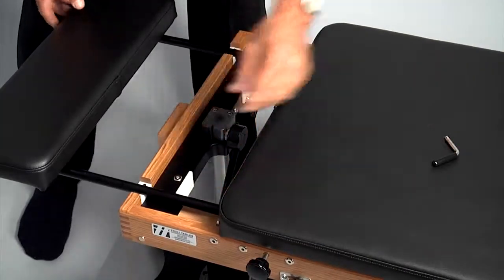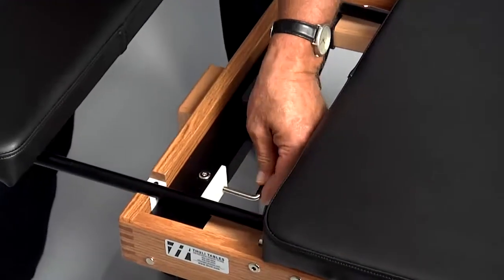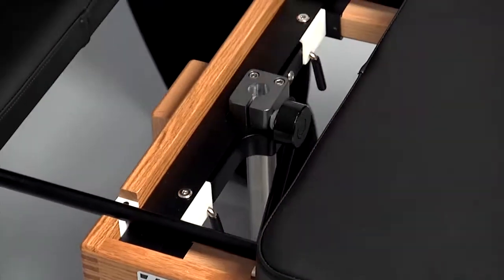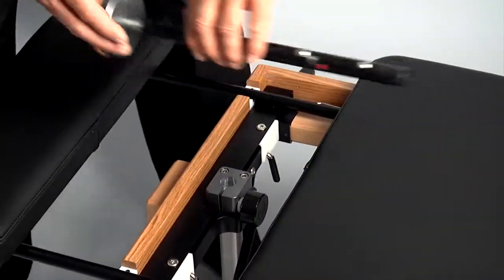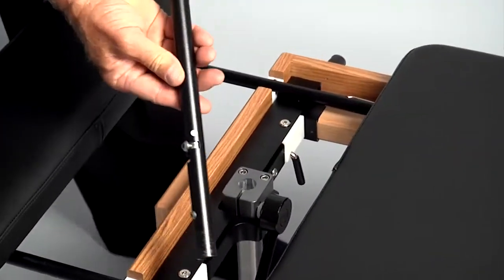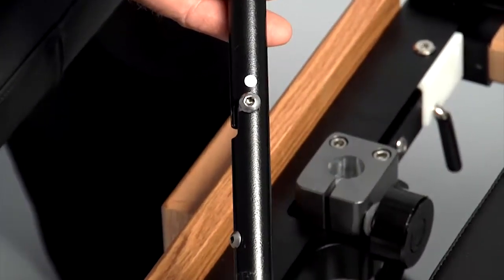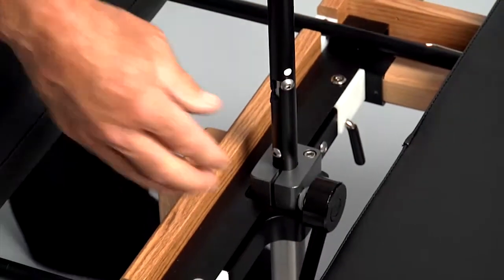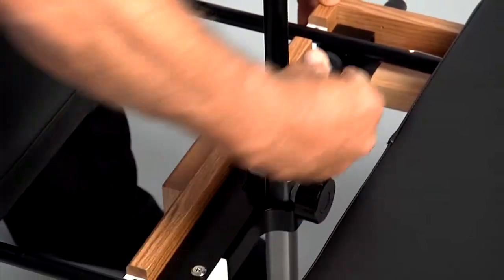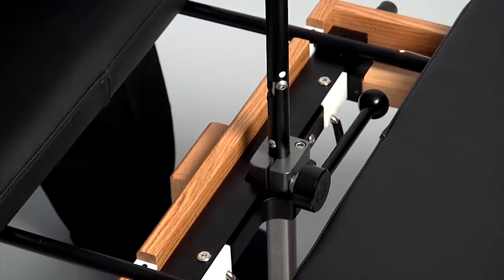To install the control knob and mast, first make sure that the mast's position indicator button is in the white position. Insert it into the flexion distraction device and lock it into place by turning the mast locking lever clockwise until it is parallel to the floor. You can change the position of this lever to suit your needs by simply popping it out away from the mechanism, adjusting, and releasing.